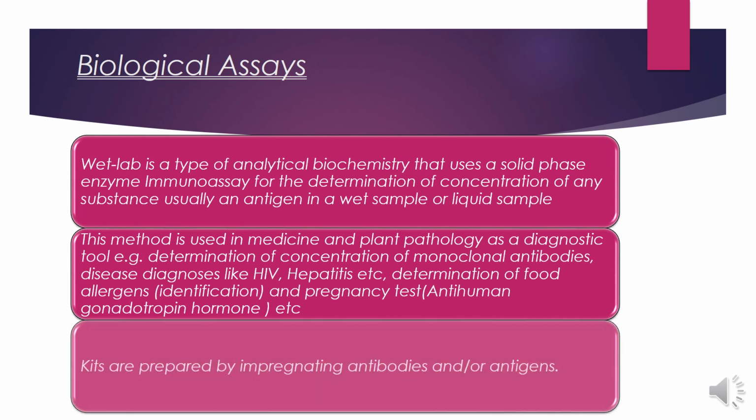So these are a few examples of it. So basically the kits, as I have discussed, are prepared by impregnating either antibodies or antigens. So depending upon the need, either antibodies or antigens are available in those specifically designed kits that use this technology.